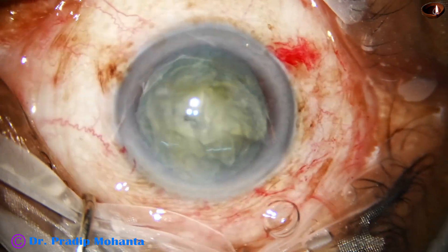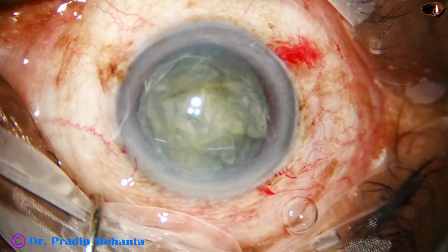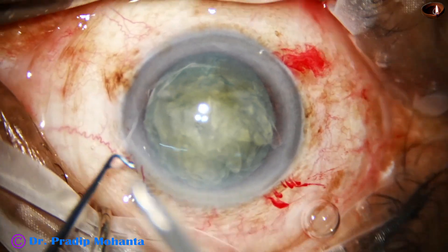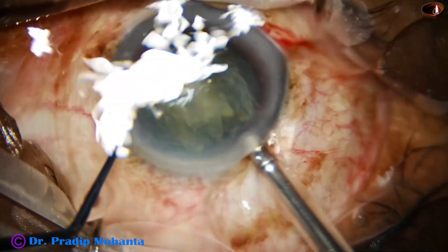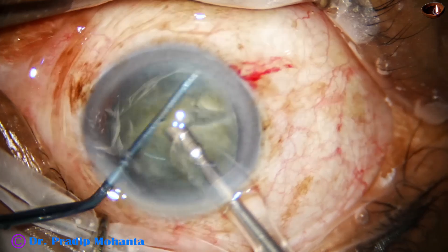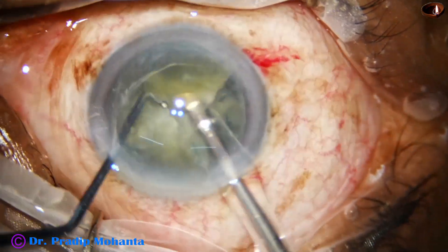Think of any other way — it will definitely take more time in the anterior chamber. Manipulations in the anterior chamber for more time means more loss of corneal endothelial cells, the precious endothelial cells.